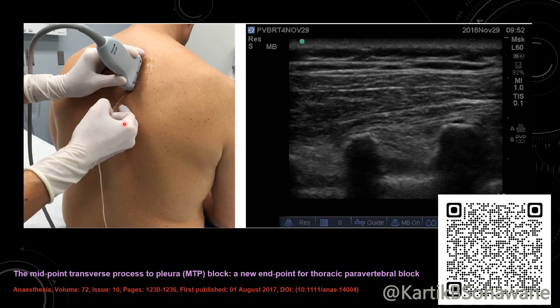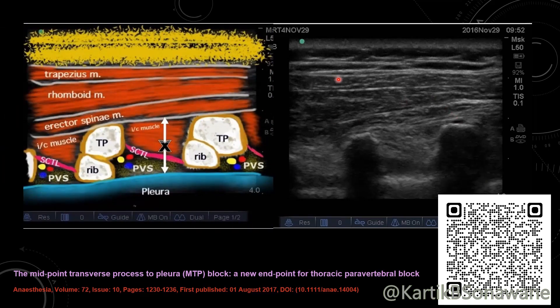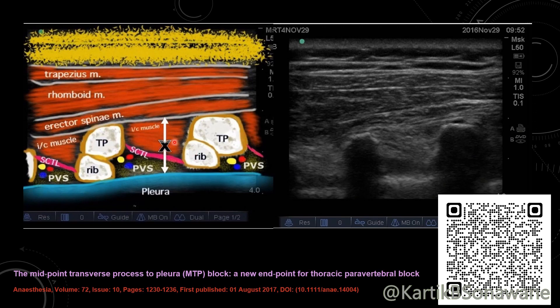The sonoanatomy picture involves the trapezius muscle and erector spinae muscle above the tip of the transverse process. Between the transverse processes lie the inter-transverse process ligament, and anterior to the superior costo-transverse ligament is the paravertebral space, which is limited anteriorly by the hyperechoic pleura. The injection point for the MTP block or ITP block is the midpoint between the tip of the transverse process and the pleura, lying in the retro-STL space — the tissue complex posterior to the superior costo-transverse ligament.